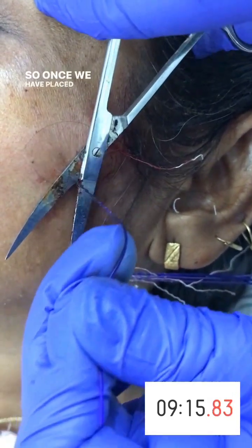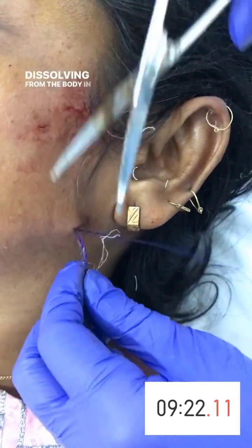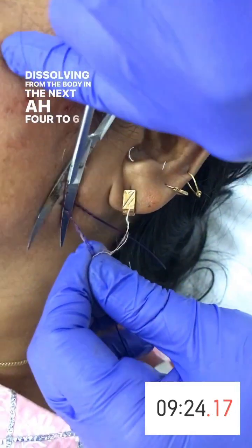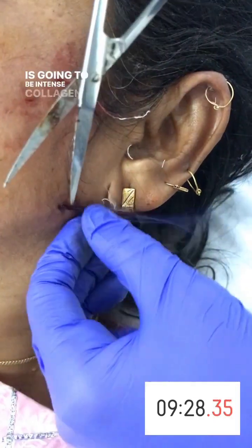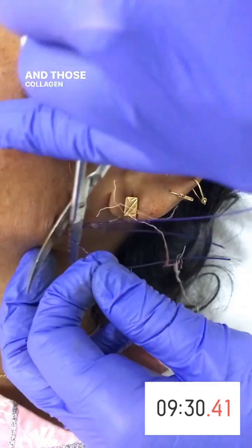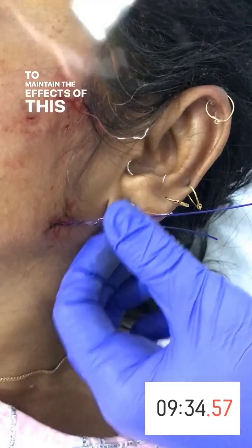Once we have placed the threads over here, they have a life. They'll be dissolving from the body in the next 4 to 6 months. But wherever we have placed the threads, all along the threads there's going to be intense collagen formation, and that collagen that your body has built is what is going to maintain the effects of this facelift.